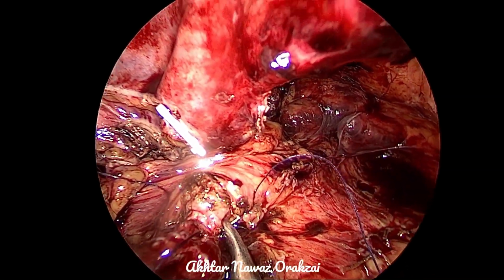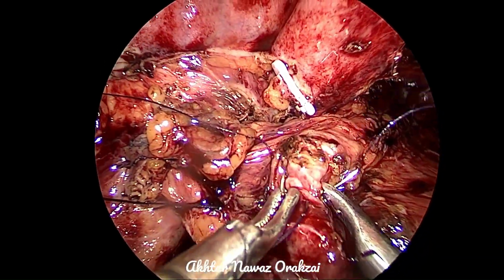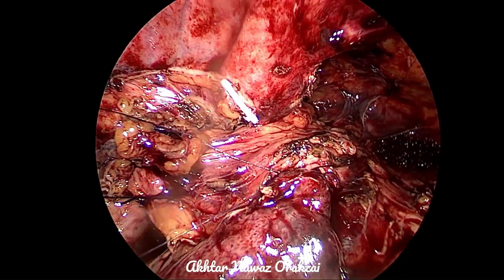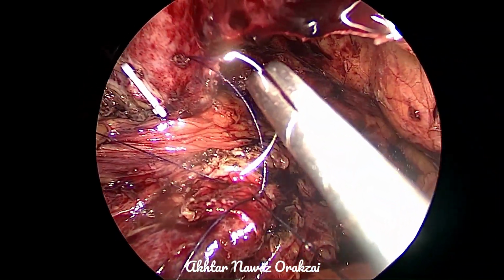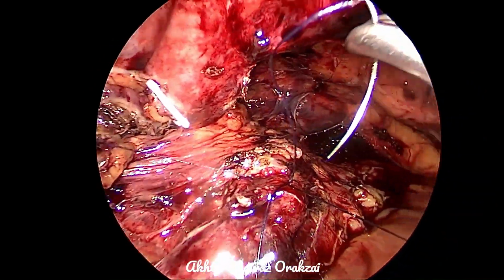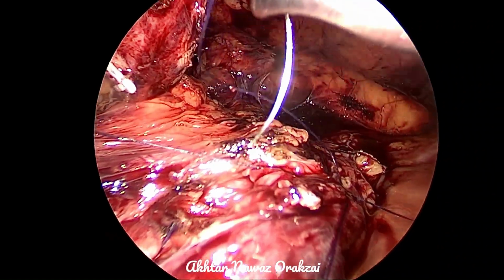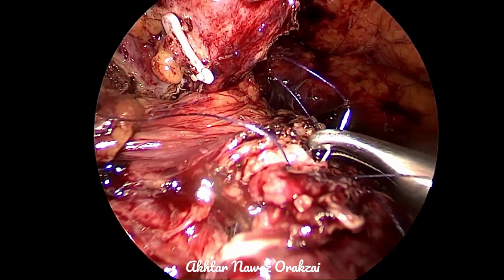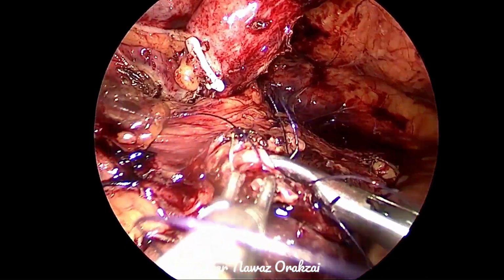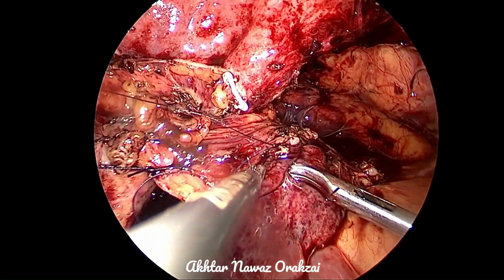So we are at the level of the suture from the opposite wall. Now the last stitch is taken. Then we will knot this suture to the opposite wall suture, and the anastomosis will be complete.